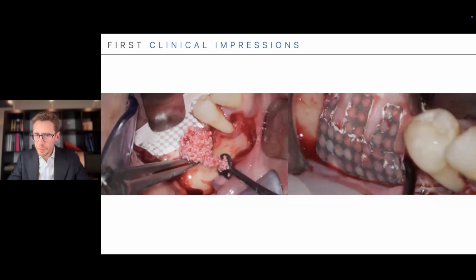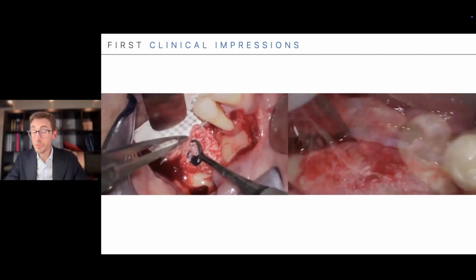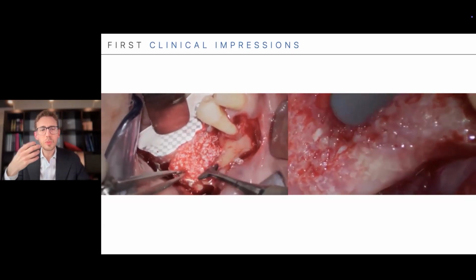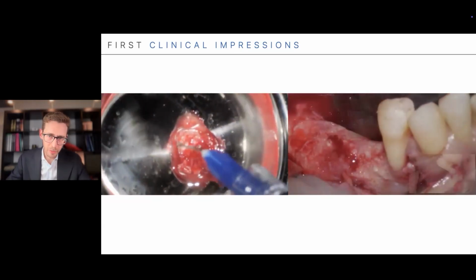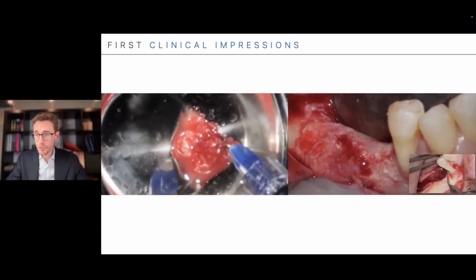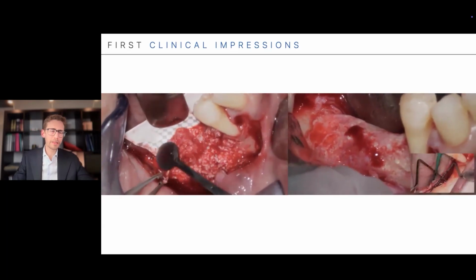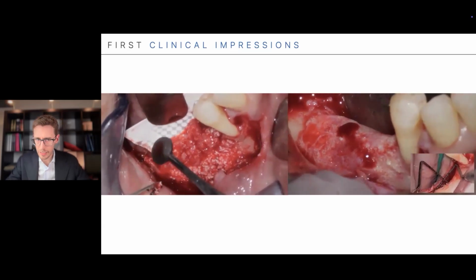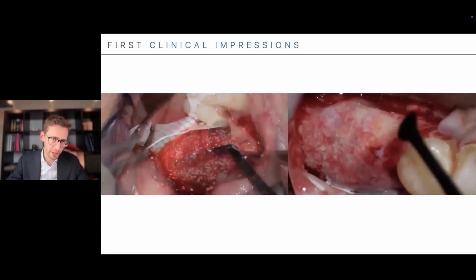And of course, the layered approach can also be applied with the use of non-resorbable membranes, but with a slight modification. Since it cannot directly target the osteoprogenitor cells of the periosteum due to the presence of the cell-occlusive membrane, what I typically do is harvest a minimal amount of autogenous bone, scraping the receiving site, and apply this minimal amount of autogenous bone on the outer aspect of the regenerative site, combined with RegenFast, right below the non-resorbable membrane.